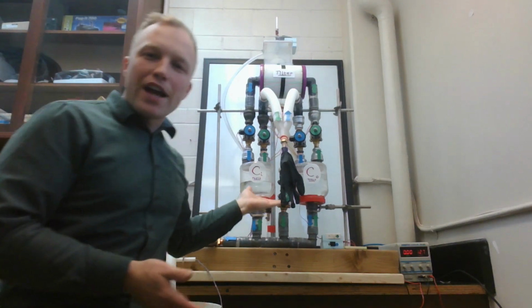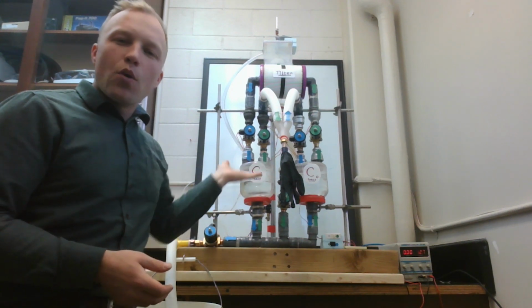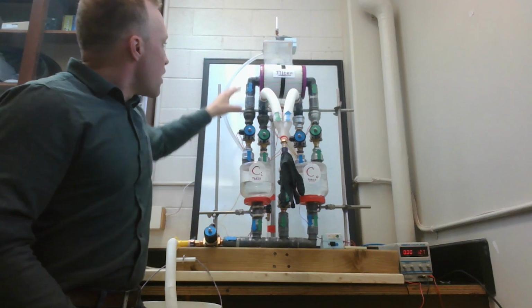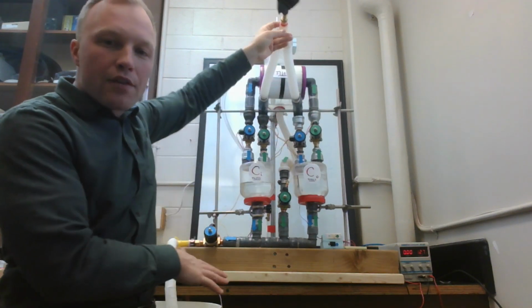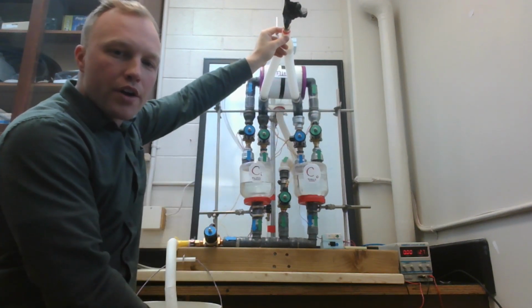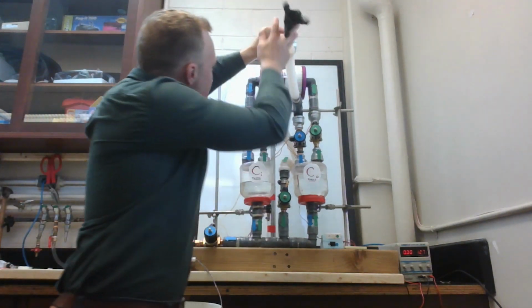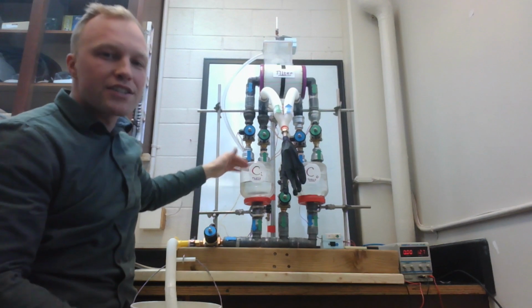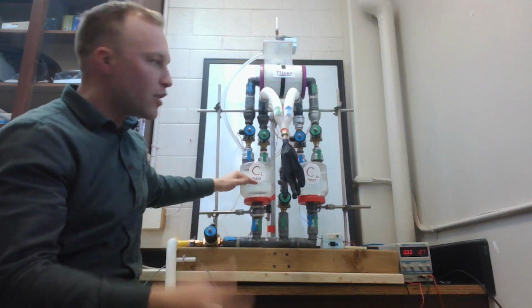Okay, so I told you what happens when the water level increases. What happens when the water level decreases? When it decreases, the blue valves are all open, so the drain of water is coming out, and we have air flowing in from the filter up here, filling the fresh cylinder. That's going to get loaded up for the next inhale breath.